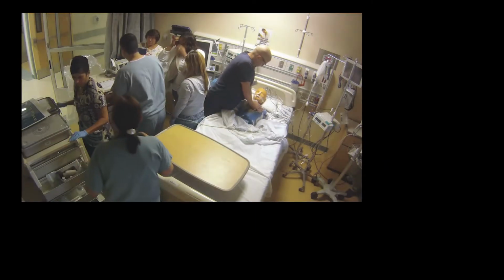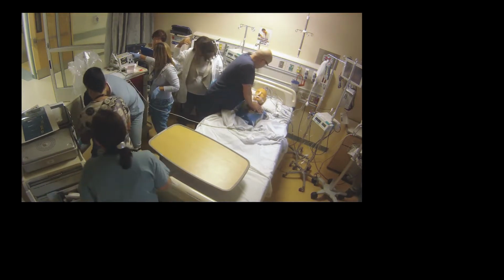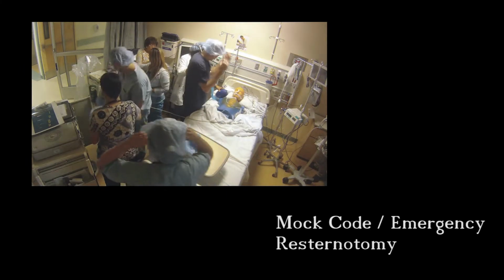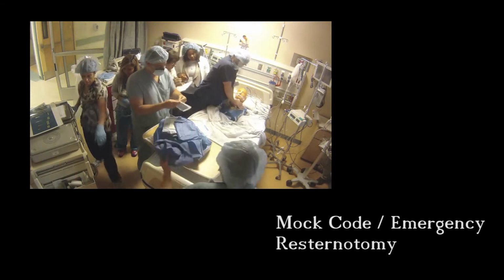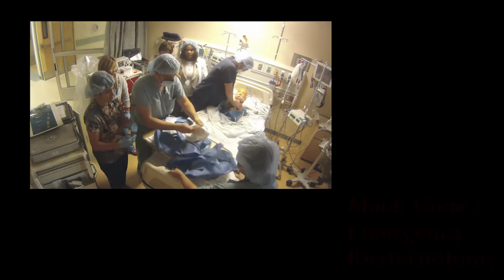In the next few minutes, you'll see how using a realistic simulation such as the one you just saw, coupled with a well-developed audit tool, can dramatically improve team competency and patient outcomes. Reopening the sternum at the bedside in post-open heart patients is one of these high-stress procedures that requires a high level of team performance. To be effective, this procedure needs to be performed in under 10 minutes.